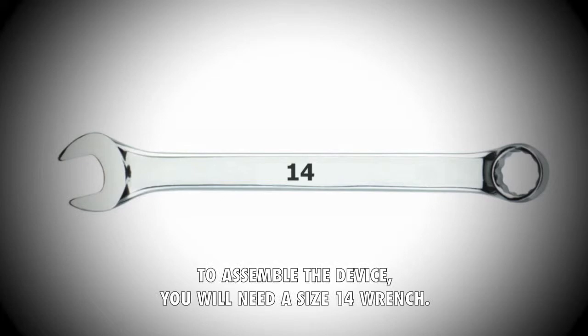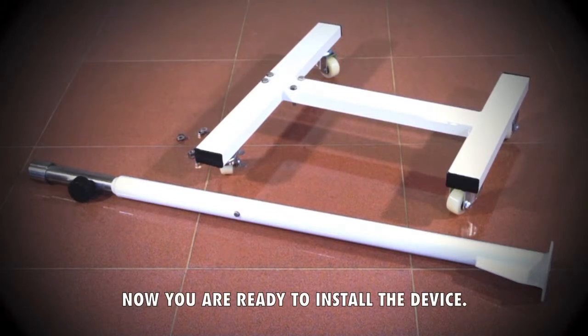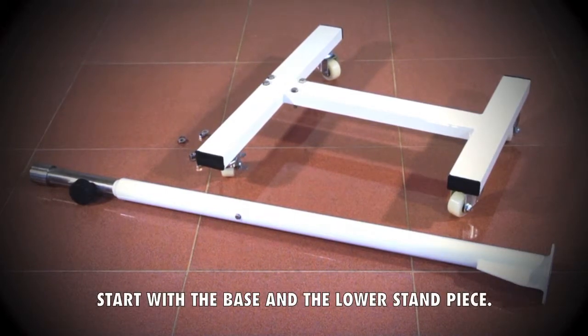To assemble the device you will need a size 14 wrench. Now you are ready to install the device. To begin you will need to assemble the stand. Start with the base and the lower stand piece.